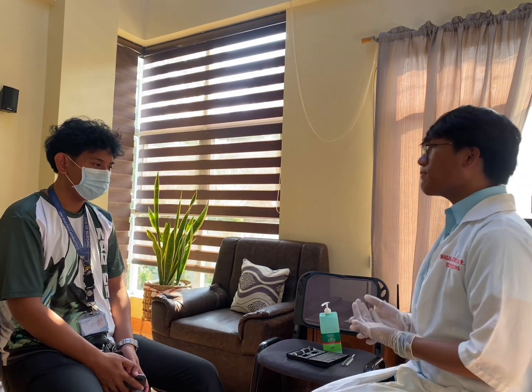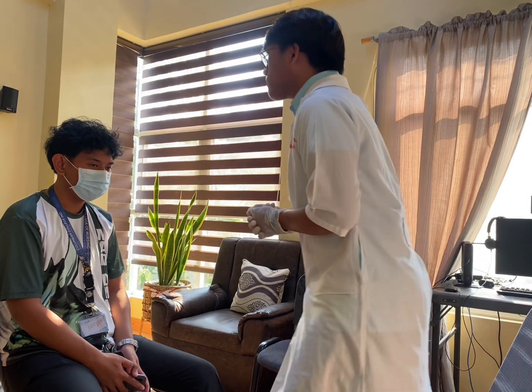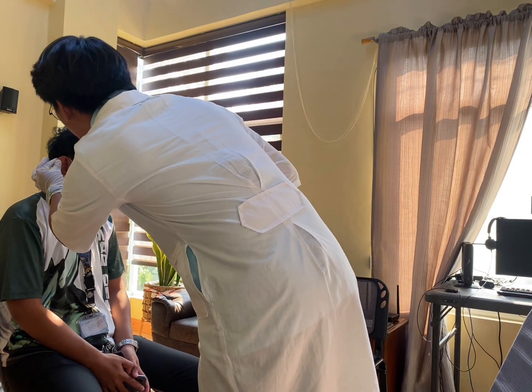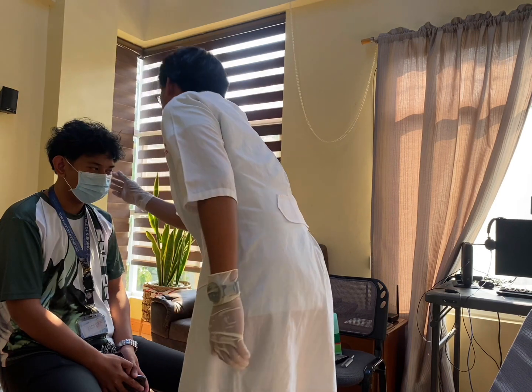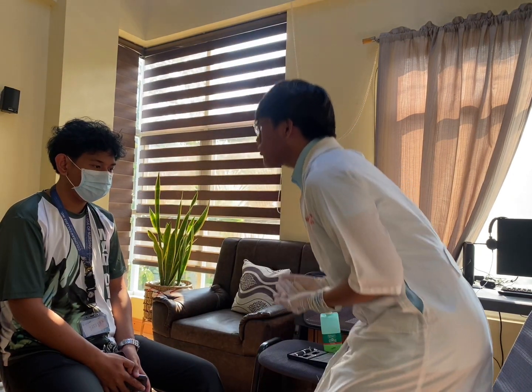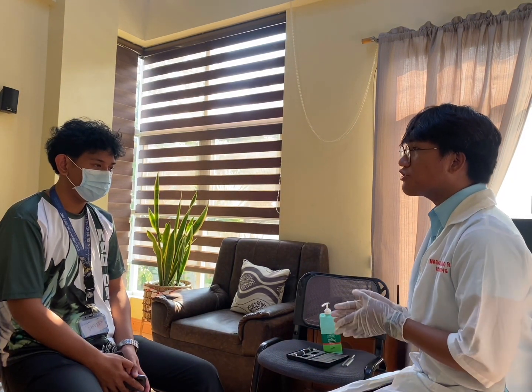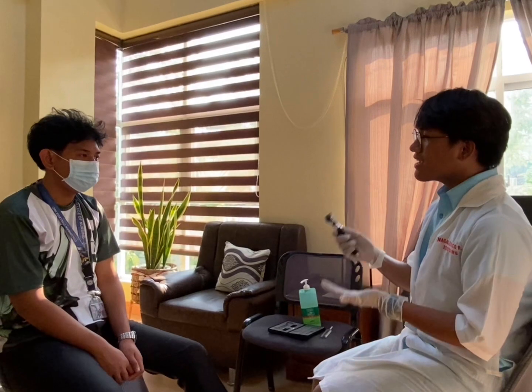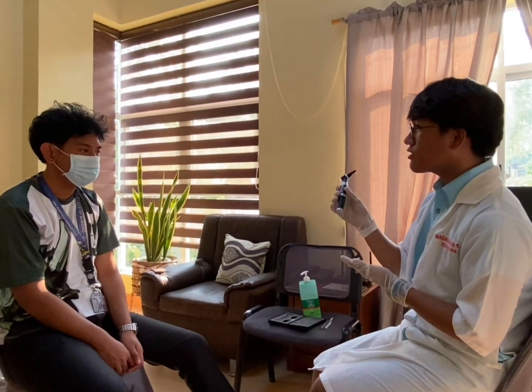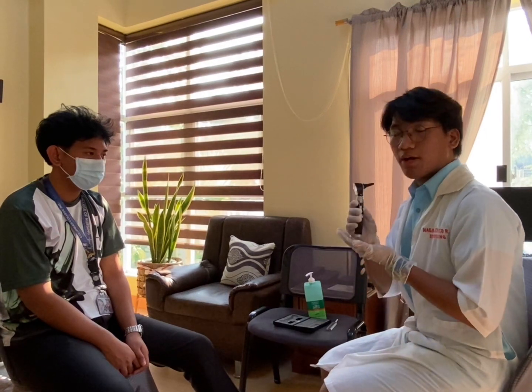Next, I'll be palpating your auricle. Now, I'll gently palpate your auricle, checking for texture, elasticity, and any areas of tenderness. As I observe, I don't see any signs of tenderness or abnormalities in texture that could suggest infection or inflammation. Next, I'll be inspecting the external ear canal and the tympanic membrane using my otoscope.